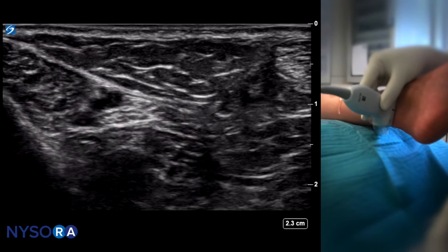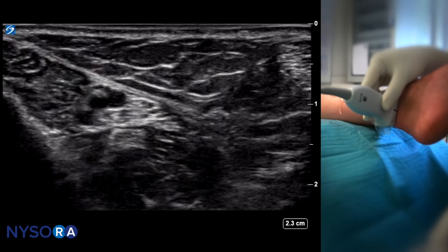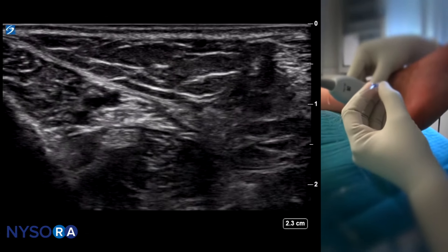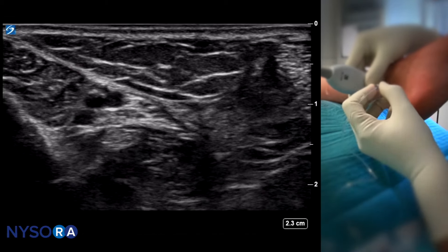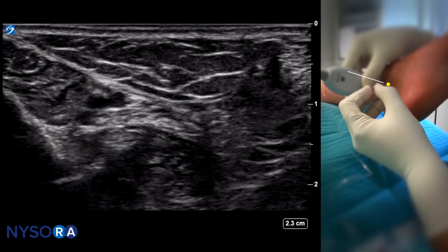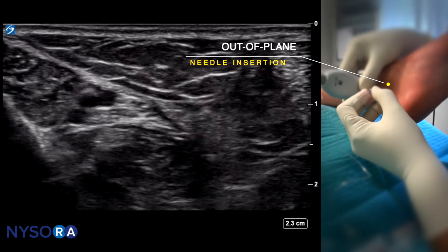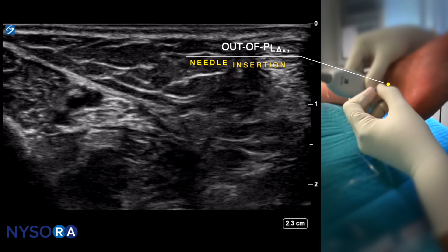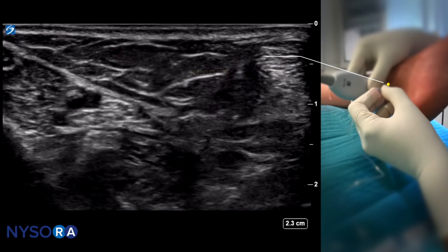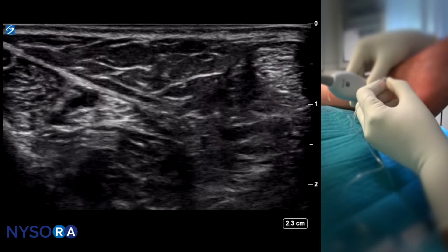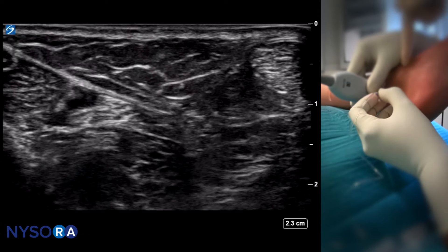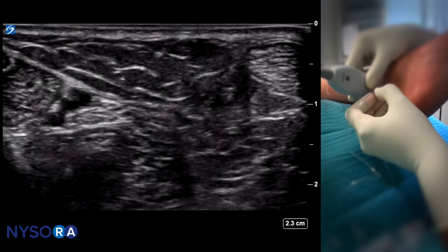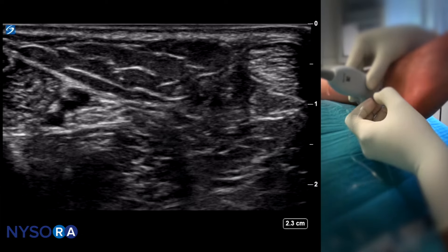It is most of the time not possible or convenient to do this block using an in-plane technique because the needle always encounters the bone. The out-of-plane technique is the most common method we utilize.